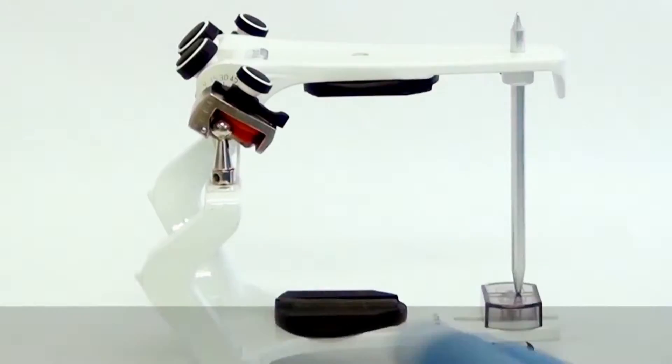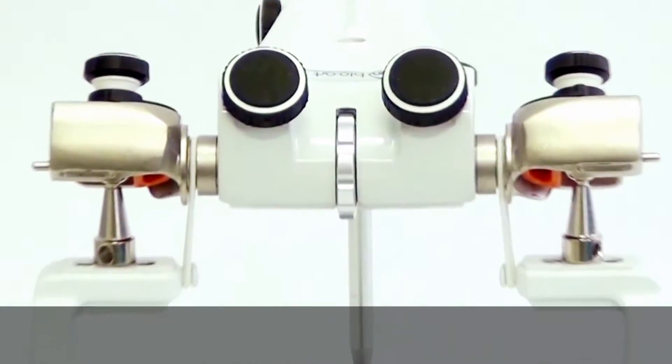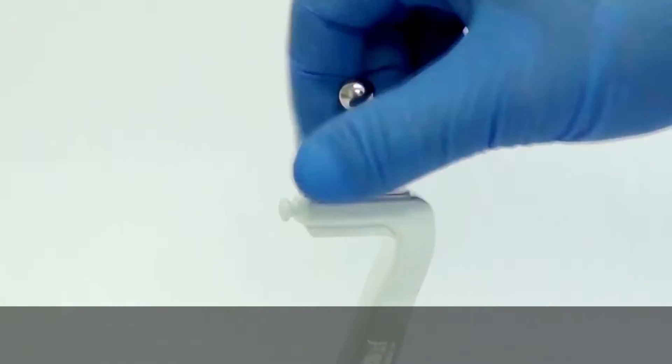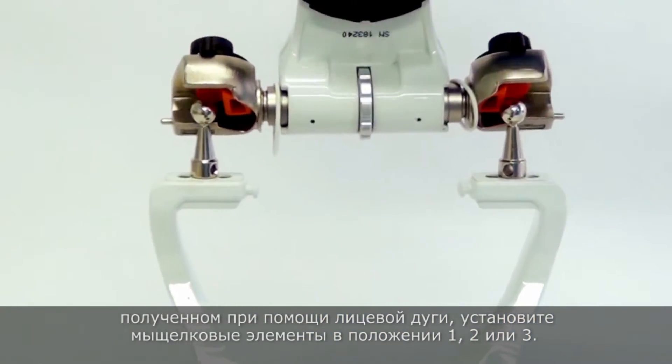Preparation of the 4000S Articulator. This model allows intercondylar distance adjustment. To place the articulator in the distance obtained with facebow, fit the condylar elements in the respective positions 1, 2, or 3.